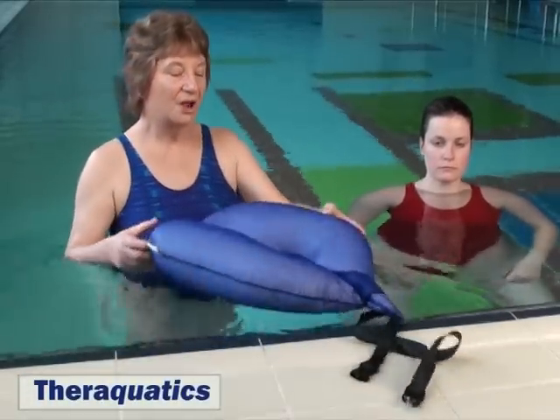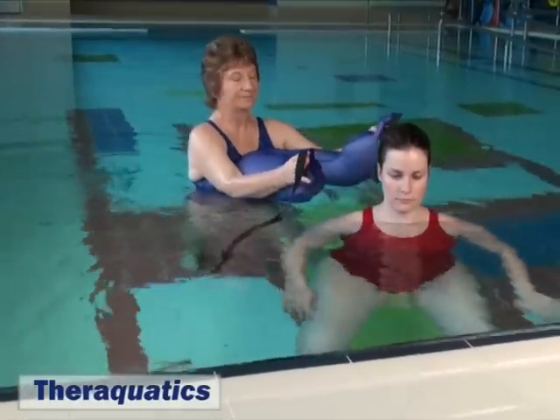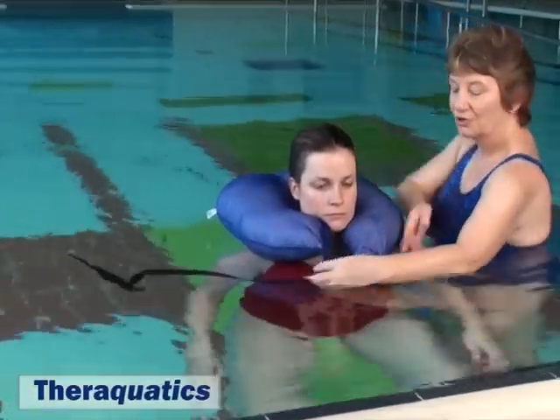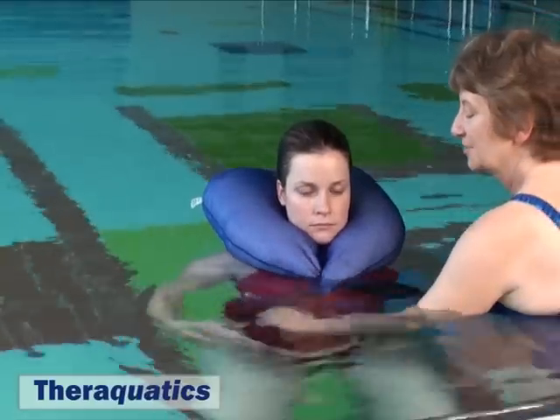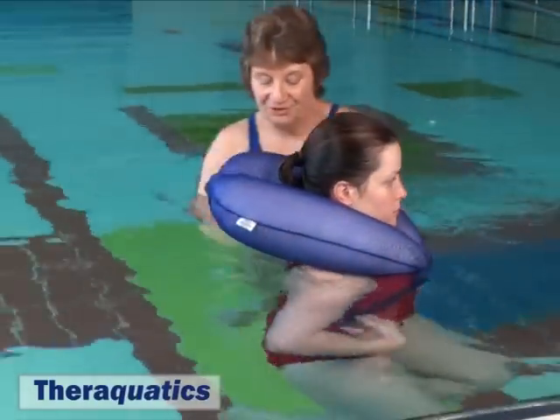It is positioned around the patient's neck by standing behind, placing it around the neck, crossing over at the front and passing the straps under the patient's arms. They may be able to assist you.